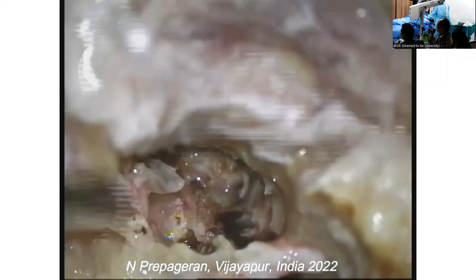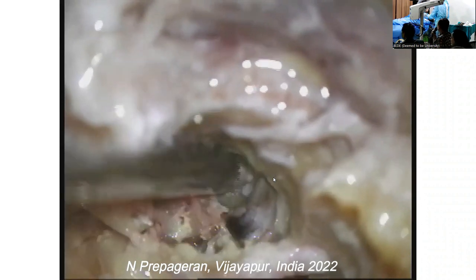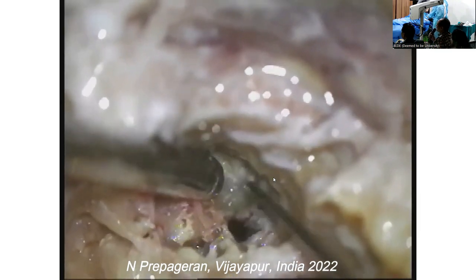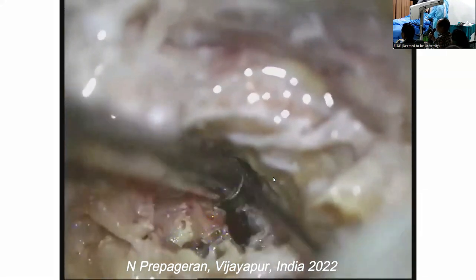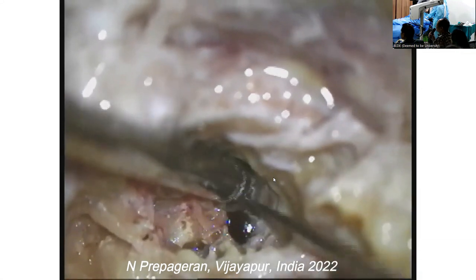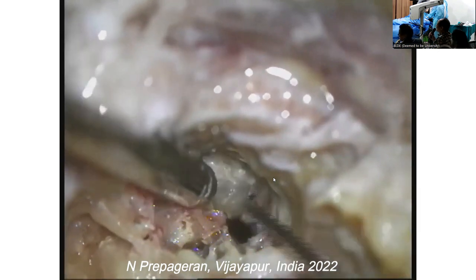That's the bulb and bleeding. Can you please tell the anesthetist we have bleeding? That's the jugular bulb, guys. Beautiful. Jugular bulb, carotid artery. This is the bone between the jugular bulb and the carotid artery, the mother-in-law, that separates the carotid artery and the jugular bulb.